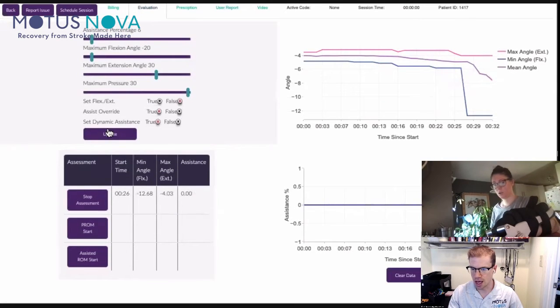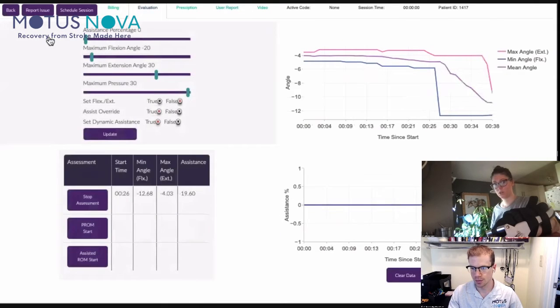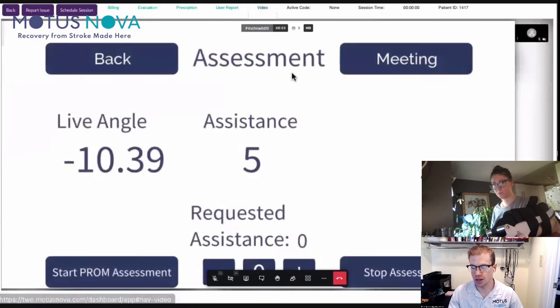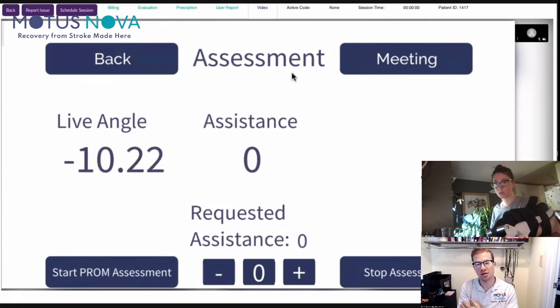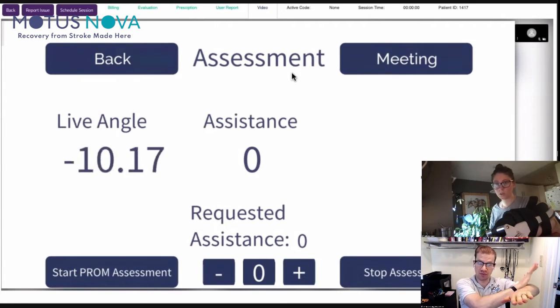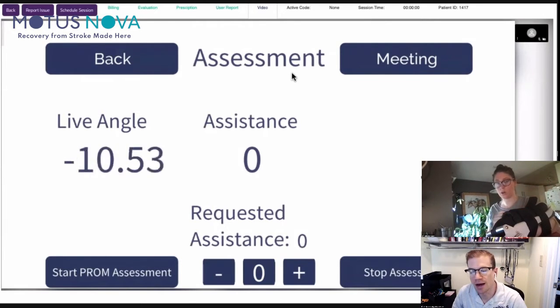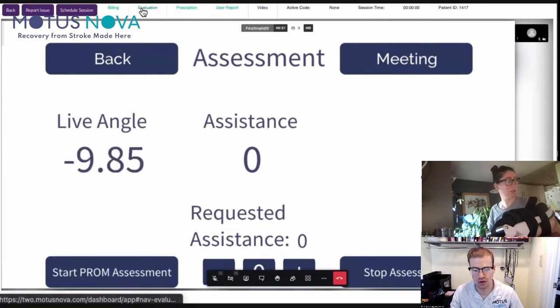I'm just going to send a quick command on my side to make sure that we are communicating. Very good. Perfect. Now, Catherine, the one problem with bracing is it prevents us from doing that bimanual, mirroring approach that I was talking to Aretha about. But what we can do is have your hand up, and you can brace with your palm, and then you can move up with your wrist. So we can do a bit of jiggery pokery, as they may say, and figure out a way to do that. But first things first, let's figure out what kind of range of motion we have.